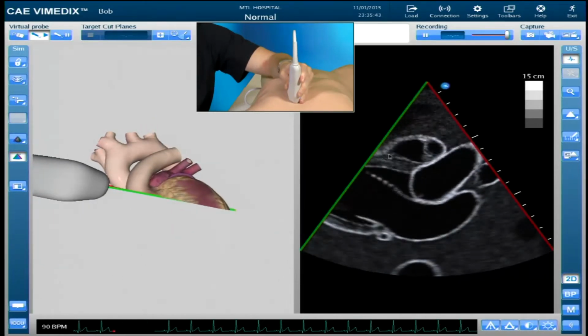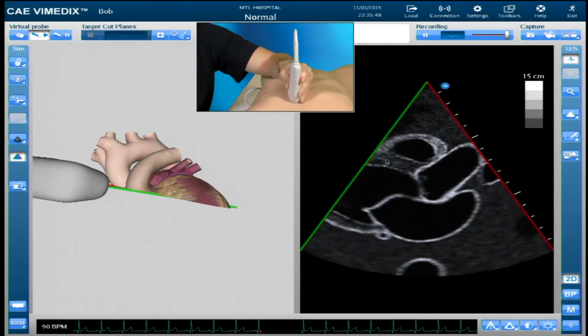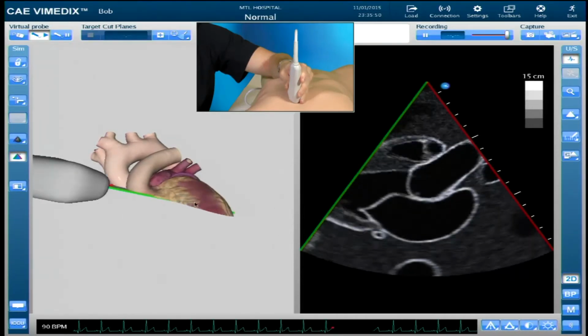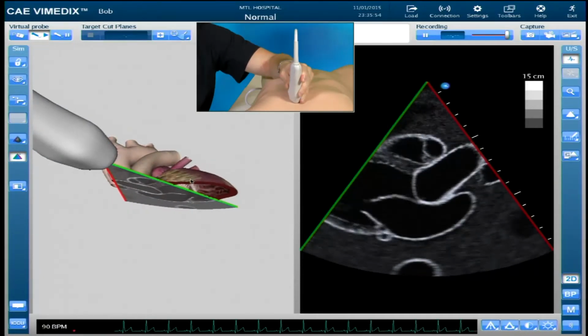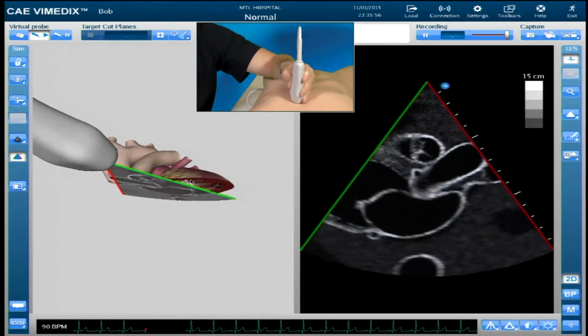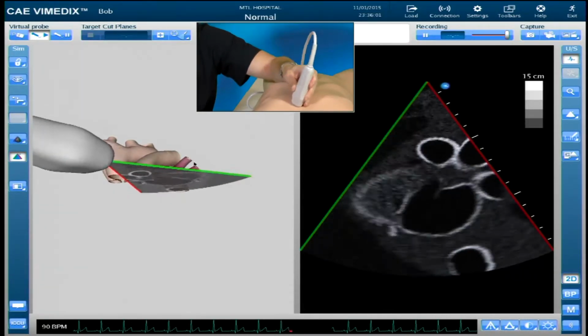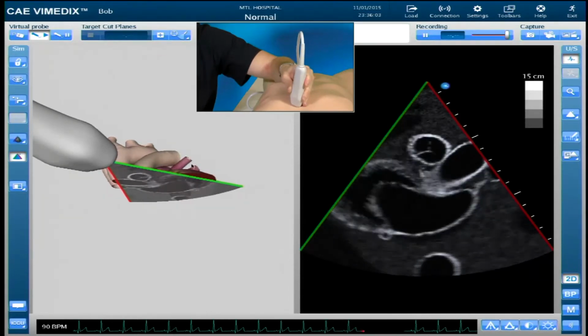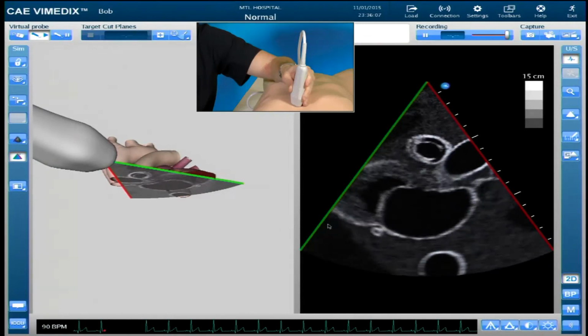Now, I talk about trying to make this left ventricle that we've got over on this echo image as big as possible. And what I mean by that is that we've got to make sure that we are looking down the gun barrel of the ventricle. What I mean by that is, watching the anatomical image over here, if I image too far back, I can make that apex become almost closed off.